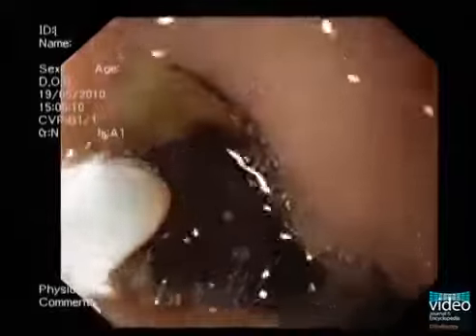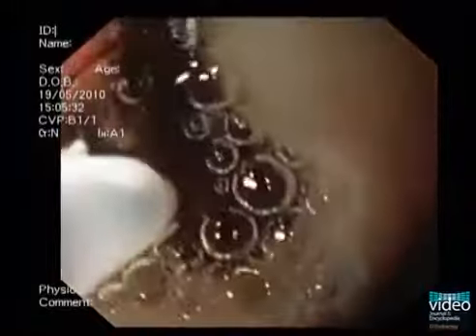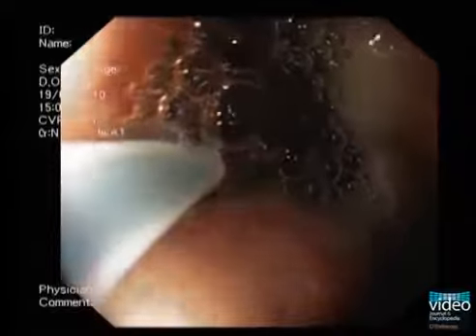When injecting diluted adrenaline, the needle is inserted about 3 millimeters from the bleeding point in order to avoid intravasal injection. The total volume injected depends on the type of ulcer. In most ulcers with an adherent clot, injection of a total volume of 5 to 10 milliliters of diluted adrenaline is sufficient.